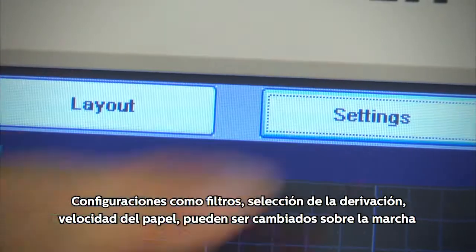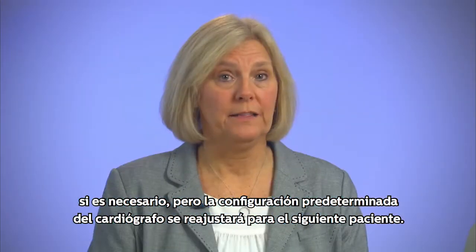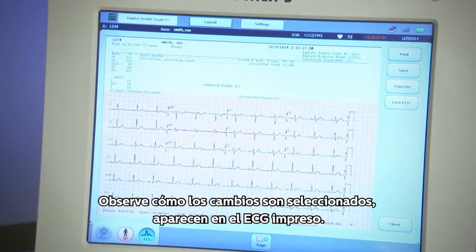Filters, lead selection, paper speed, and gain may all be changed on the fly if necessary, but the cardiograph default settings will automatically reset for the next patient. See how the changes are selected.